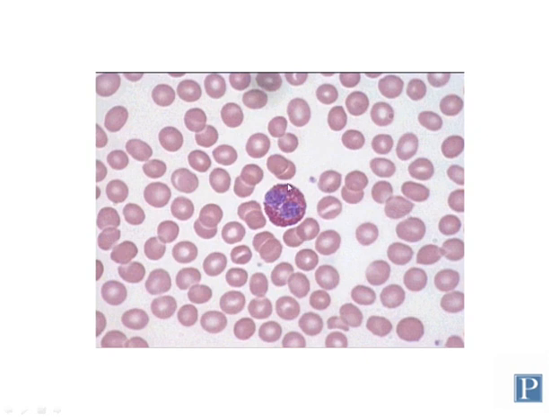This cell is a more rare type of white blood cell, which is called an eosinophil. Now, neutrophils and eosinophils are both classified as granulocytes because they possess granules in the cytoplasm. However, the granules of neutrophils are very hard to detect because they're chemically neutral. Eosinophils get their name because their granules are very eosinophilic, and so they stain this kind of deep red.